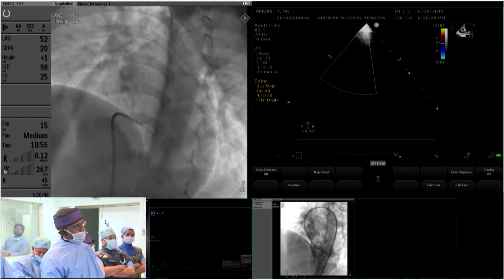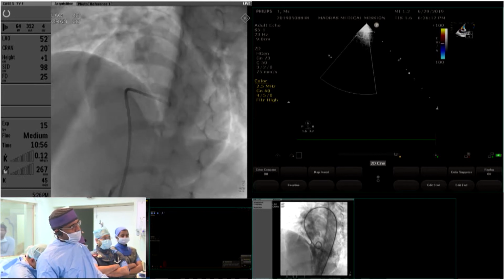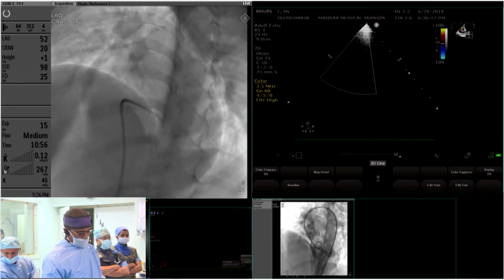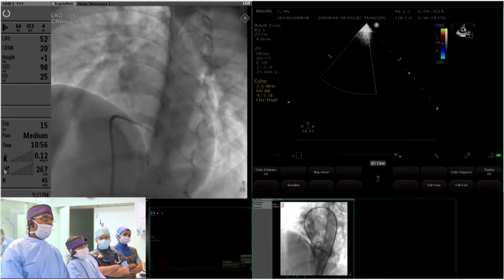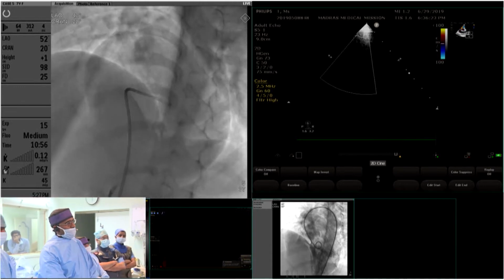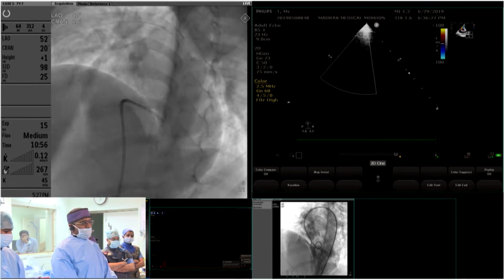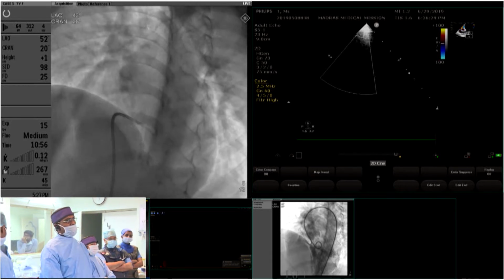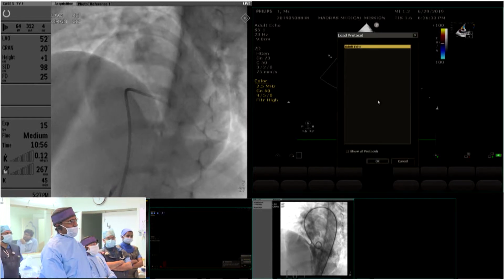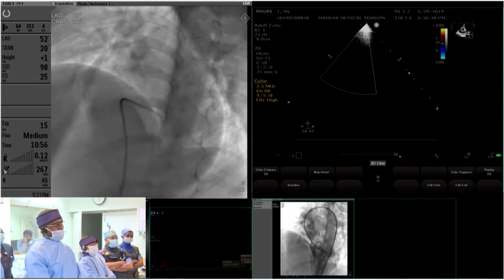What's the downside of a 10-8 as opposed to 8-6? Well, only a question of size. So 10-8, I would have no qualms about it either. Now, the ways in which we can do this, if you are going to be doing it from the transvenous axis, whether we are going to be crossing from the LV, making an AV circuit, and then advancing the sheath, or try to cross from the right ventricular surface, antegrade, and go across the VSD.